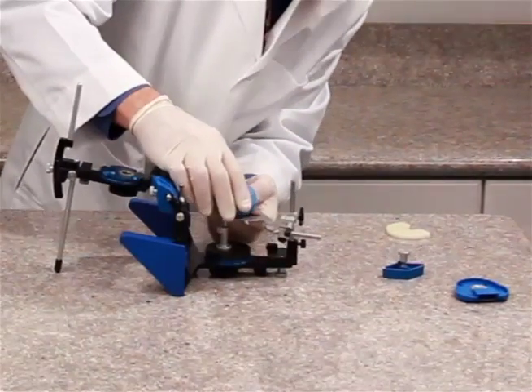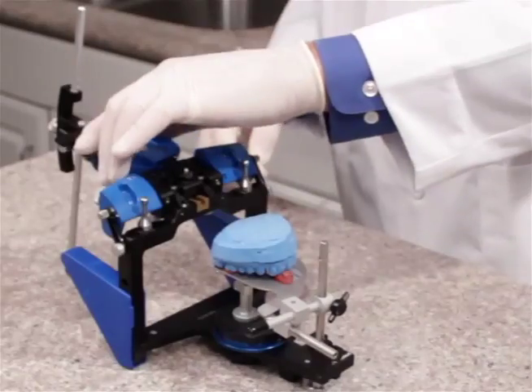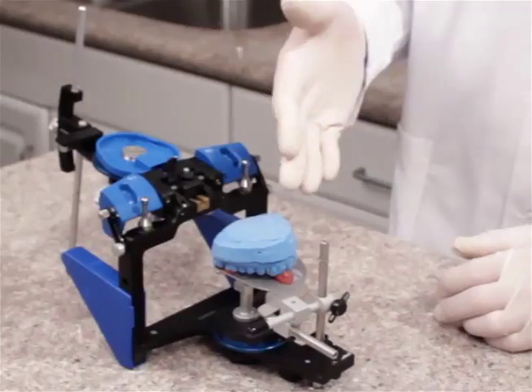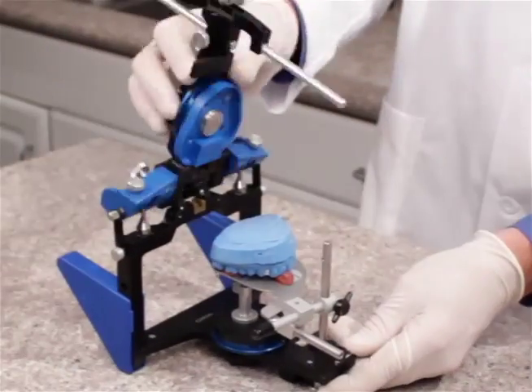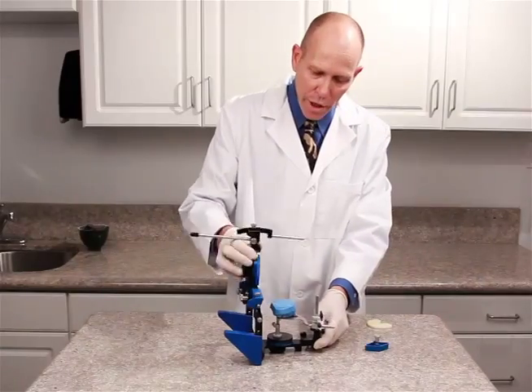We can now add our casts to the indentations on our bifork registration. We can add a mounting plate to the upper frame. We can go ahead and mix plaster at this time and add it to the mounting plate and to the cast, making a connection of the upper cast to the upper frame of the articulator.